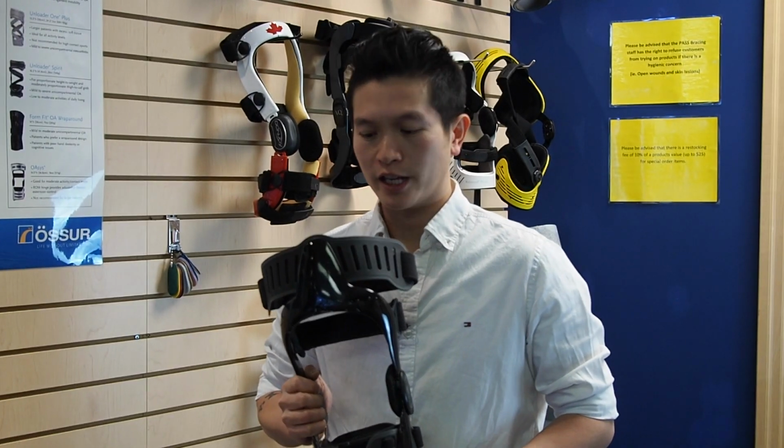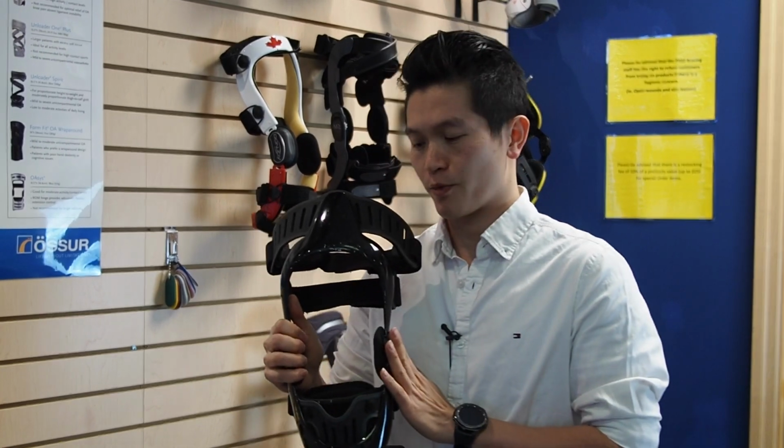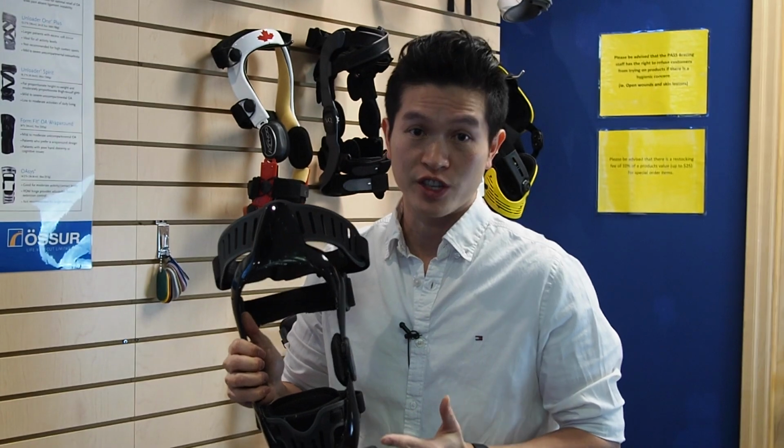So today we're going to go through just changing the parts on this brace to let you know what parts can be changeable. Of course, this is only applicable to this brace. The refurbishment kit can include everything from new straps to new pads to new liners. This is an off-the-shelf brace, so all the parts are just generic.